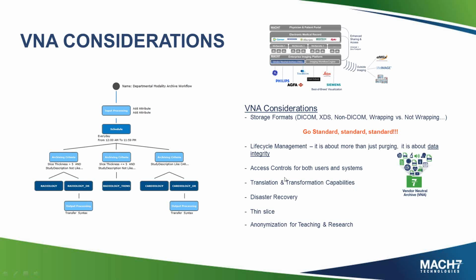Translation and transformation capabilities. We've talked about this a bit. Does that VNA give you the ability to translate and transform the data so it's in a standards-based format? So we don't have to worry about converting proprietary formats to a standards-based format later. Especially while you have those front-end systems, those modality and potentially PACS vendors that are creating those proprietary formats, while they are customers and on good terms, now's the time to work out how you get some of those things converted to a standards format. Disaster recovery. Does the VNA support disaster recovery, or does it solely depend on the storage vendor, which may be okay too, but there could be some nice advances.